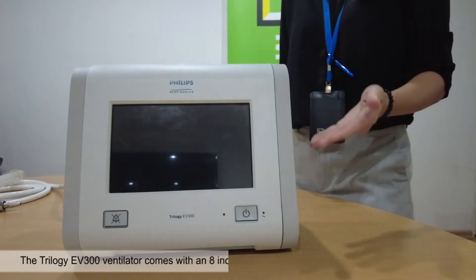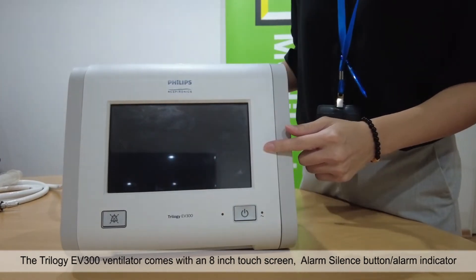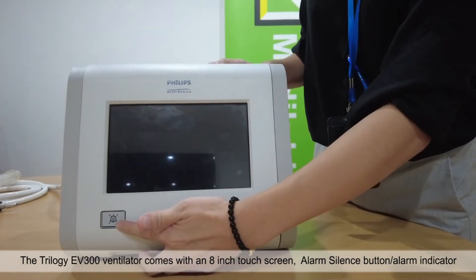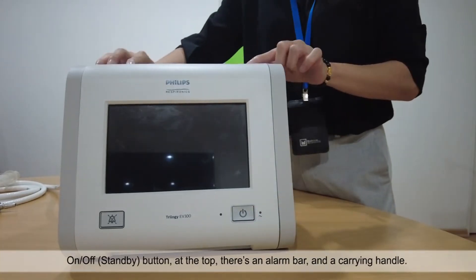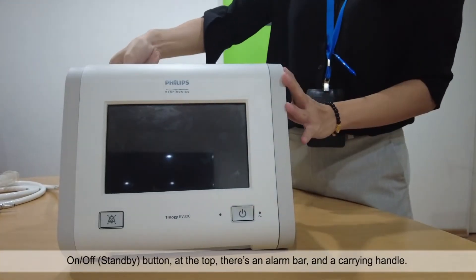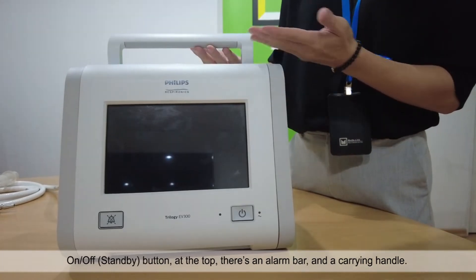The Trilogy EV300 Ventilator comes with an 8-inch touchscreen, alarm silence button and alarm indicator, on-off standby button. At the top there's an alarm bar and a carrying handle.